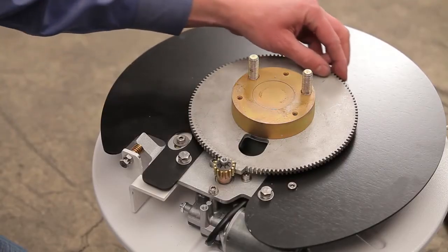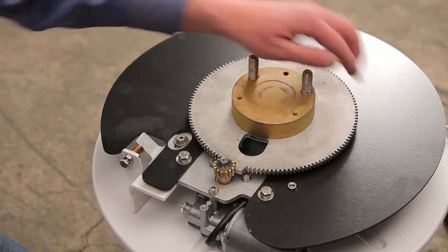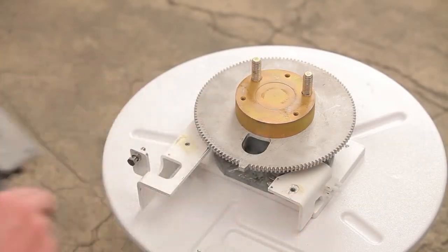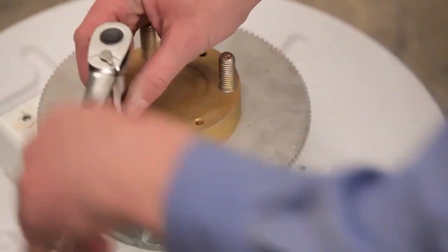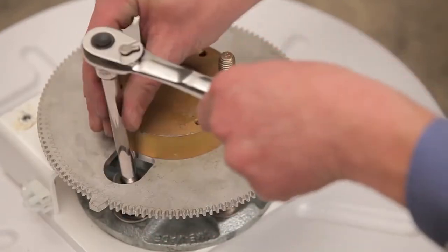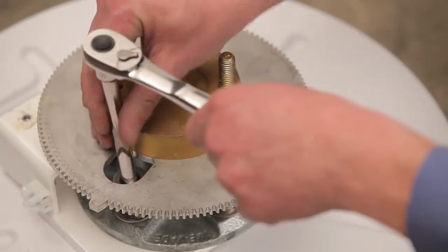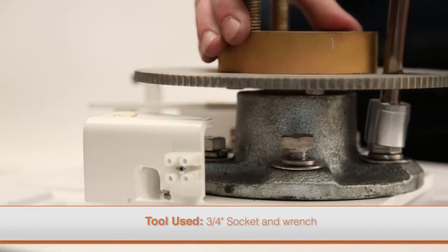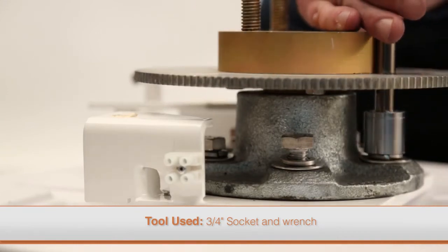If the large gear is damaged, then the hub assembly needs to be replaced. To remove the hub assembly, the motor assembly must first be removed. Refer to previous steps regarding removal of the motor assembly. To remove the hub assembly on the splash, rotate the large gear so that the opening in the gear aligns with one of the mounting bolts. Using a socket, remove all of the bolts.